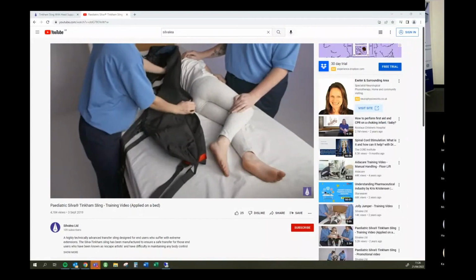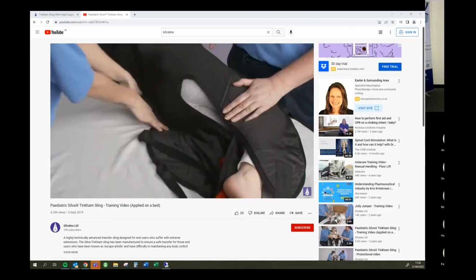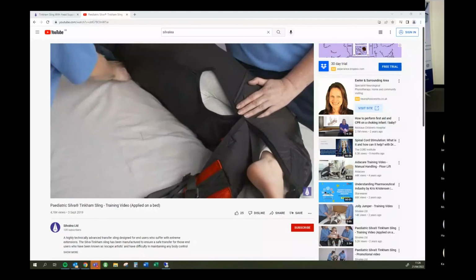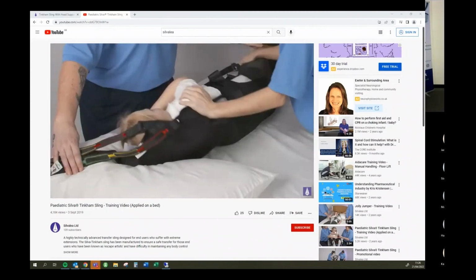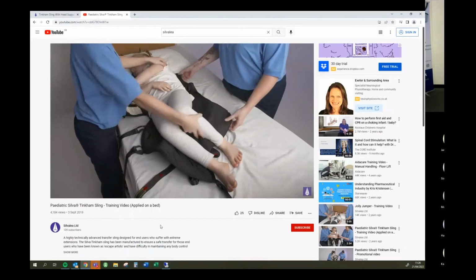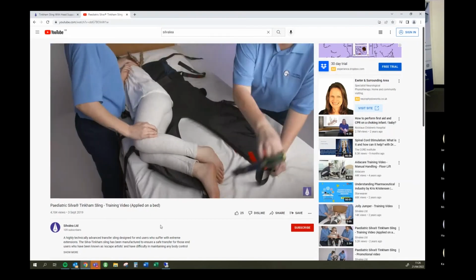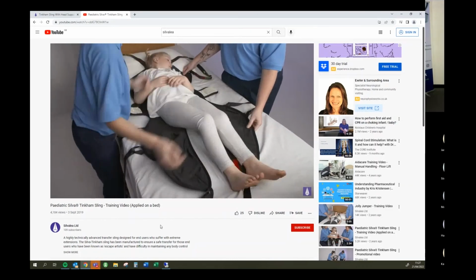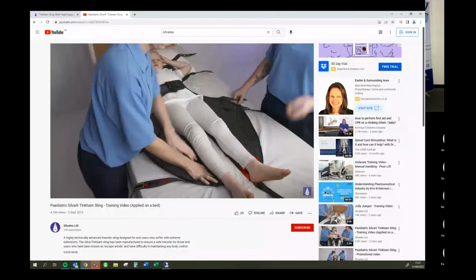And as I said, you need to get the sling in position, wrap it over to make sure you've got the waist support. It's a good indication of its positioning there. So get the waist support in and then roll the youngster back to fit the waist support. So a little soft clunk click. The leg sections have got Parasilk on, which will, as before, help with the easy glide of inserting. So here they're just making sure that it's centrally positioned so that it's in the right place to start with, which always helps. But that is in position at the waist.